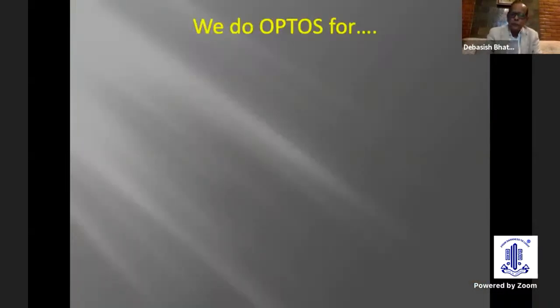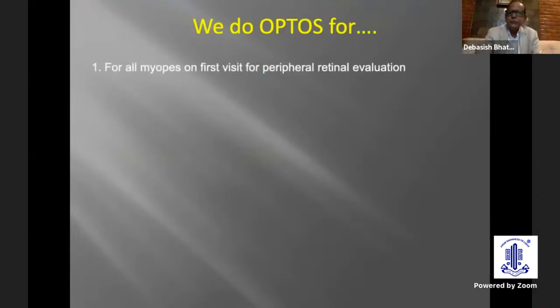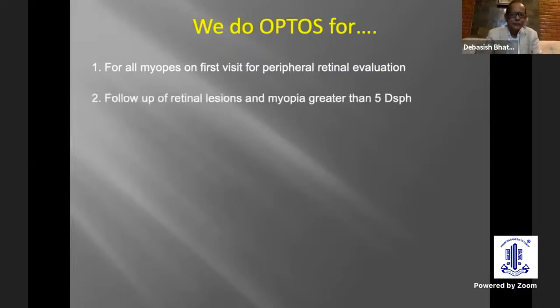So we do OPTOS as a screening tool for many things. All myopes, we advise that on first visit, have a peripheral retinal evaluation with OPTOS. We tell the retinal doctors can also do it. As Chaitra is busy in her Saturday clinic in Bangalore, so retina specialists are busy. So this is a useful alternative where we can screen every myopic retina, and we do that in Disha.